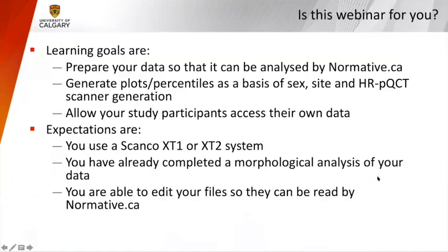So the goals of this webinar are to show you how to prepare your data so that it can be analyzed by normative.ca, teach you how to generate the plots and the measurements of percentile on the basis of sex, skeletal site, and HRpQCT scanner generation, and also to show you how to allow your study participants to access their own data or to share their data with them.